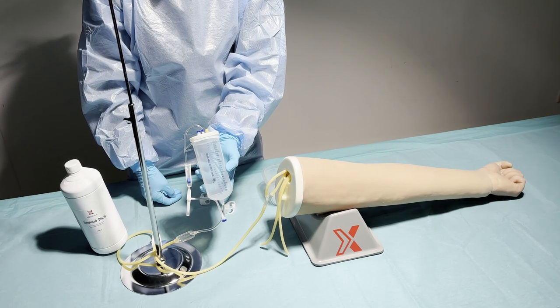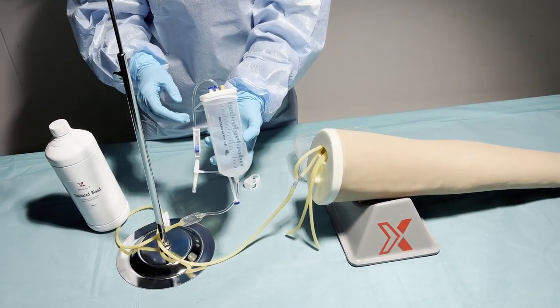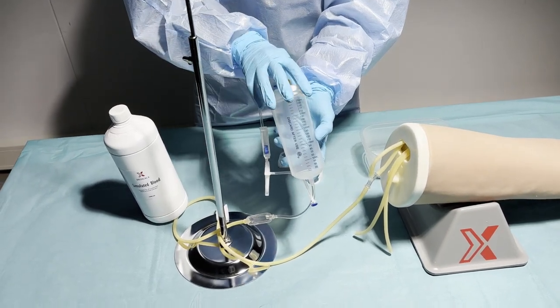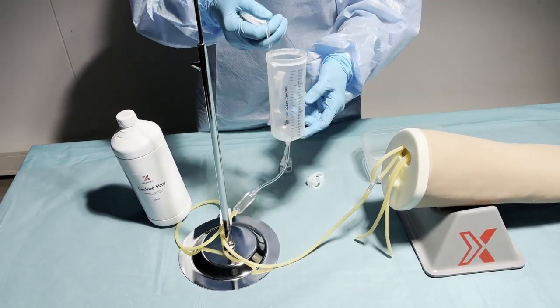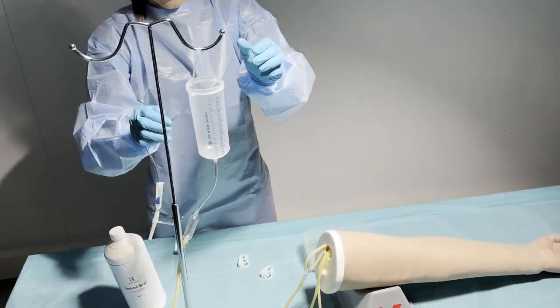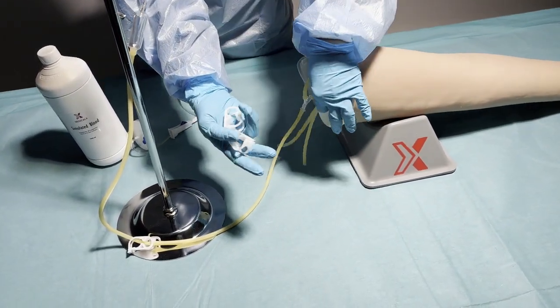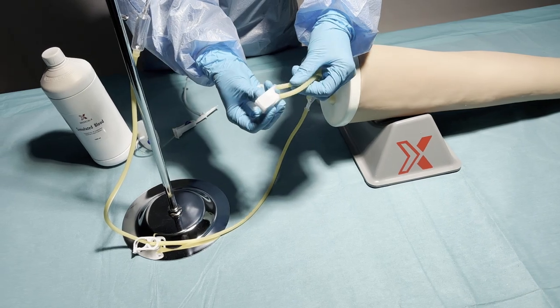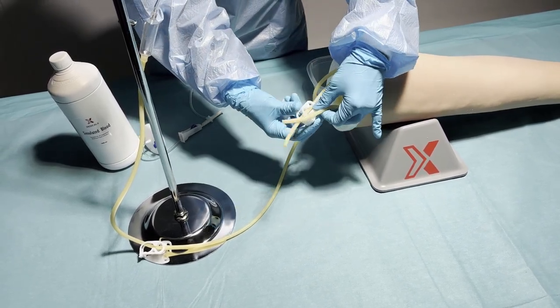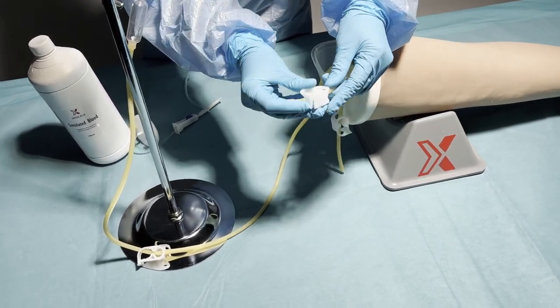Now that the IV arm is connected with the IV bottle, we can fill the bottle with simulated blood. First we take off the lid of the bottle and then we can hang the bottle on the IV stand. Now we make sure to place the clips on the two open veins. When the blood starts to come out, we can close the veins.